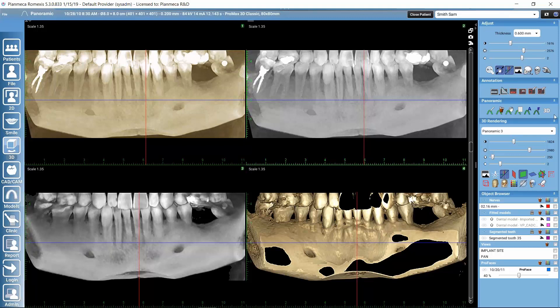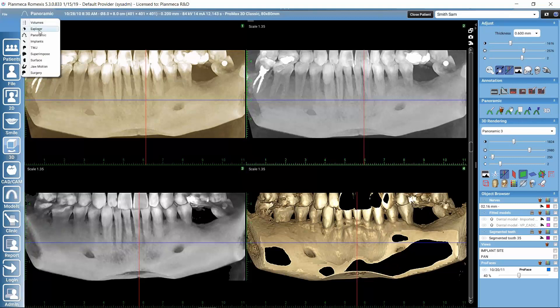Finally, we have the panoramic tools here in the panoramic sub-module. These tools are also available in the implants or cross sections sub-module, so panoramic views can also be created there.